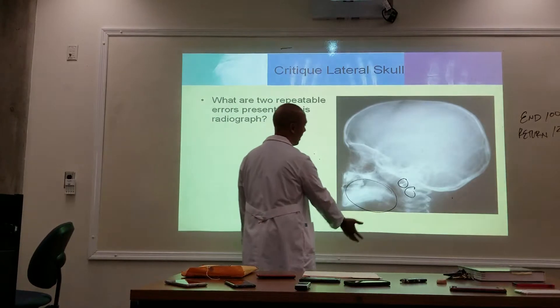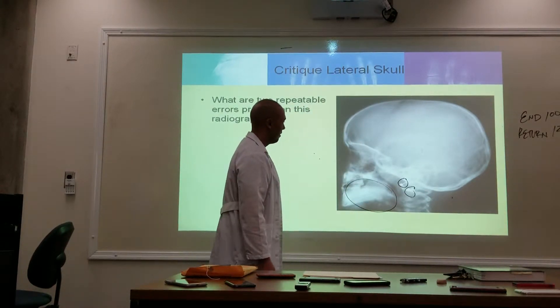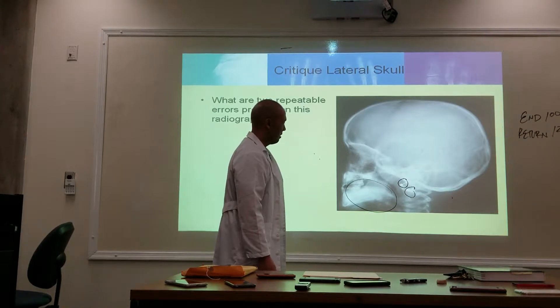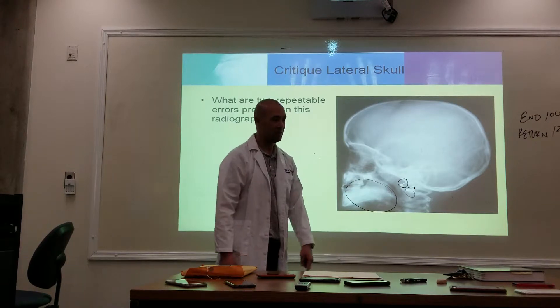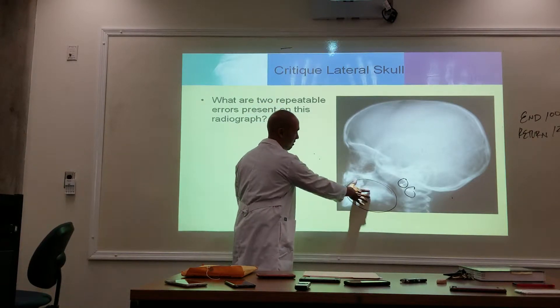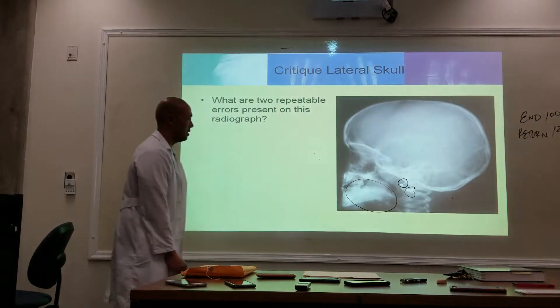Do we need to look at the entire jaw? No. This is a kid — looks youngish — so we don't need to include the entire jaw here. This is probably the hand of the parent holding the kid's head. That's a hand — they're holding the child's head.